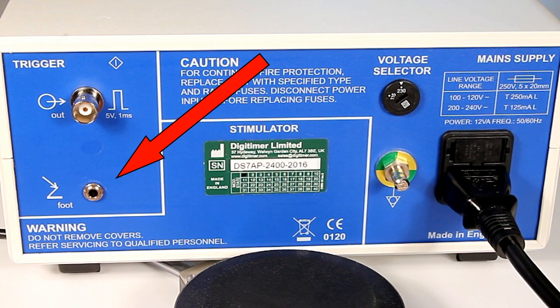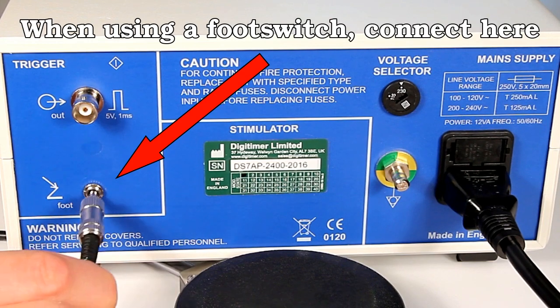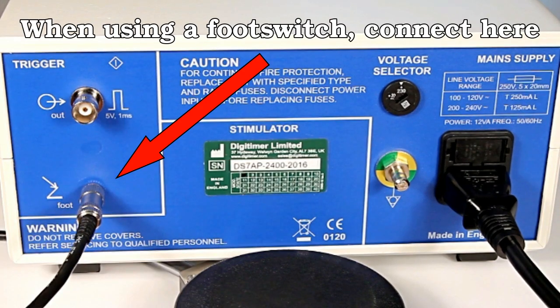If you have our D185FS1 footswitch, please connect the plug to the footswitch socket also located on the rear of the stimulator.